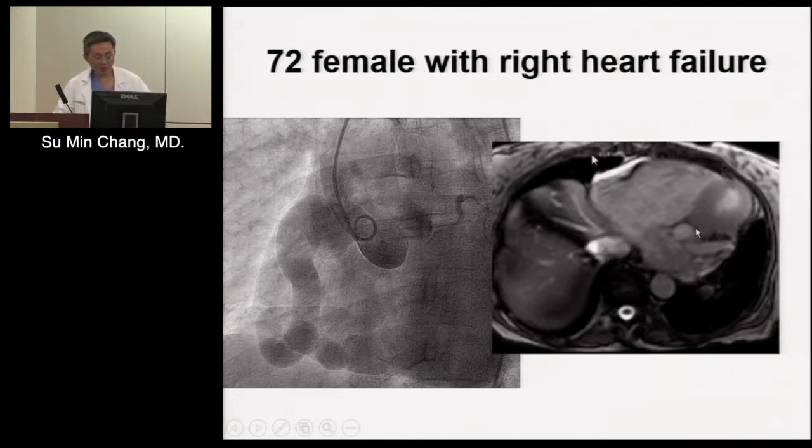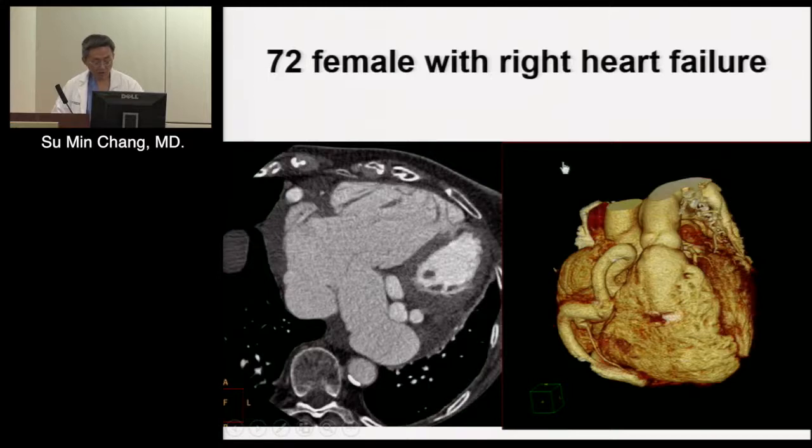So there was suspicion of, obviously, some congenital anomaly, probably an arteriovenous malformation, a fistula, with a very large RCA. MRI kind of confirmed that a little bit, but without the anatomical detail the CT could offer. As you can see here, a very large RV, a very large RA, a gigantic coronary sinus, and you can see this snake-like structure, which is the RCA.